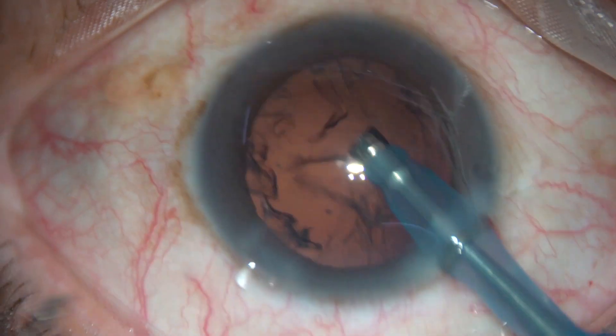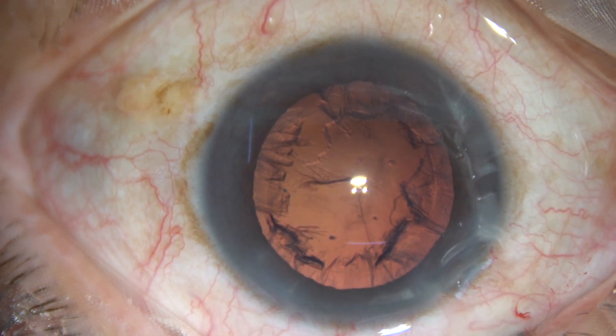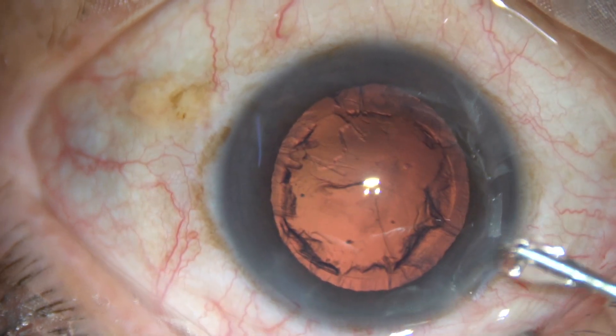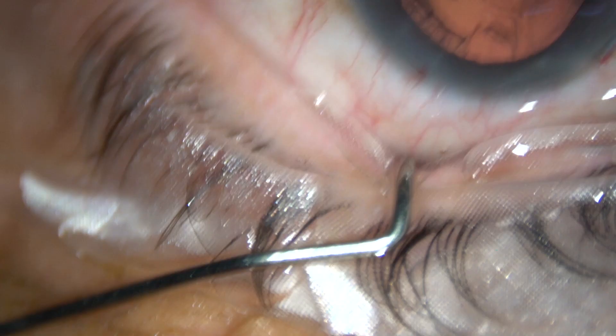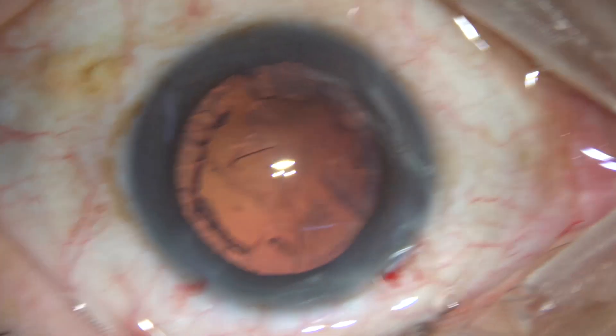That is it. The nucleus is managed. Now a lot of cortex is there in this case. A little bit of viscoelastic substance is injected into the anterior chamber. And now a 23-gauge Simcoe cannula is taken.